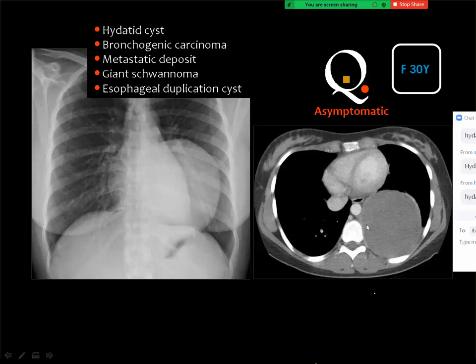But actually, you know that schwannomas are usually closer to the density of cystic rather than solid. Frequently, we introduce a fine needle to aspirate fluid from these lesions, but we fail. Then we introduce the true-cut needle, and we get a core biopsy.